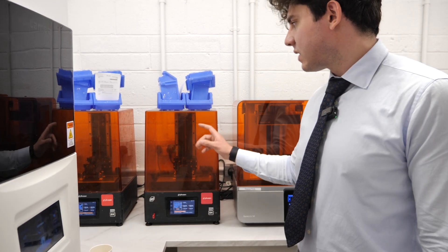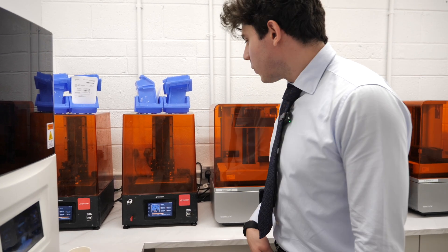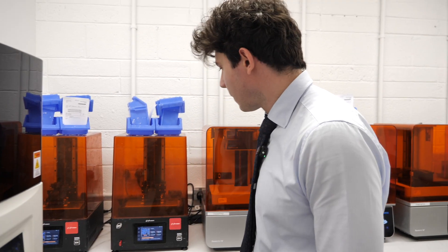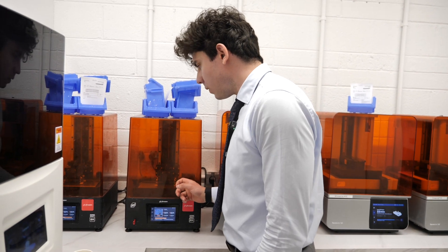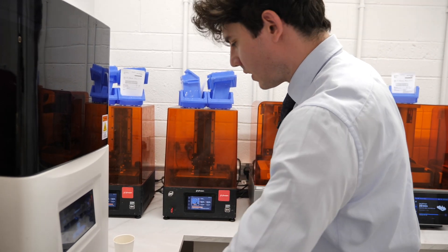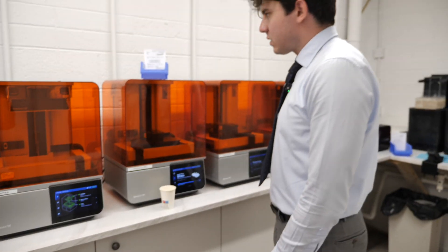The Phrozen printers are about 1,000 euros — you can get ten of these for the price of one SprintRay. They're perfectly fine for models, and Phrozen now makes their own dental model resins which are also about ten times cheaper. We can even have the patient's name inscribed on the model.